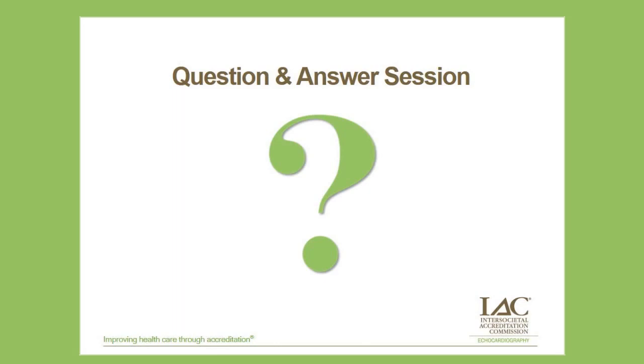Okay, Diana asks, do strain evaluations need to be done before you start chemo, or can you get a baseline after they have already had a treatment or two? So the answer is before. You don't want to incorporate any element of confusion. And as I have mentioned, there are patients that can react to chemotherapy adversely even with the first dose. So obviously you want to get a baseline as to how the patient looked before receiving any potentially cardiotoxic therapies.